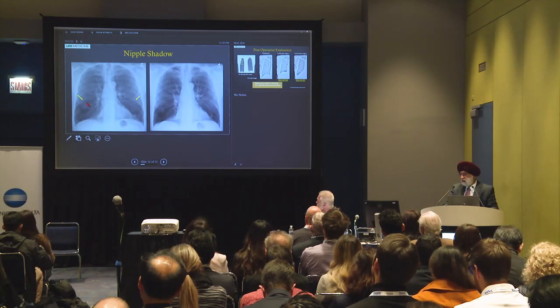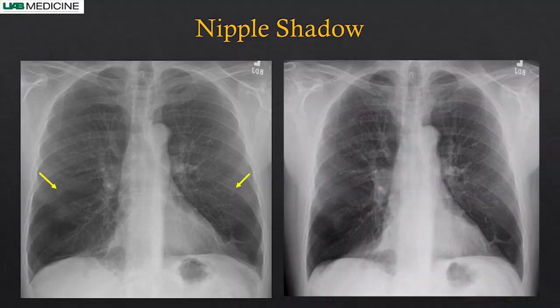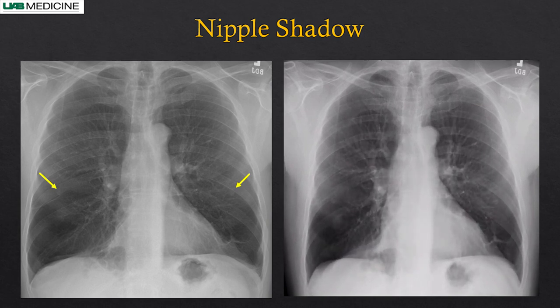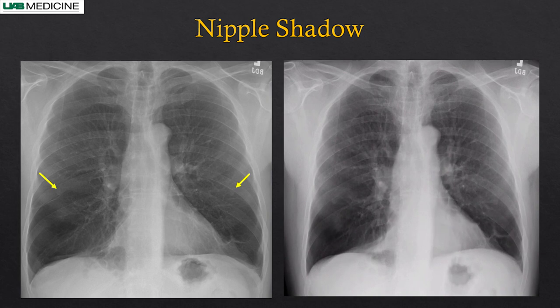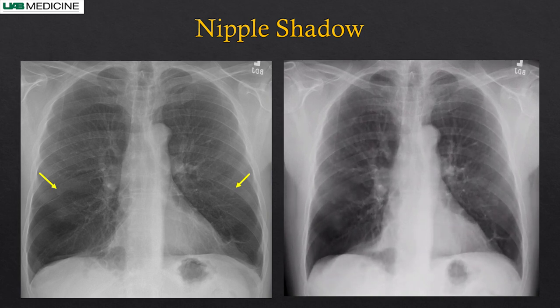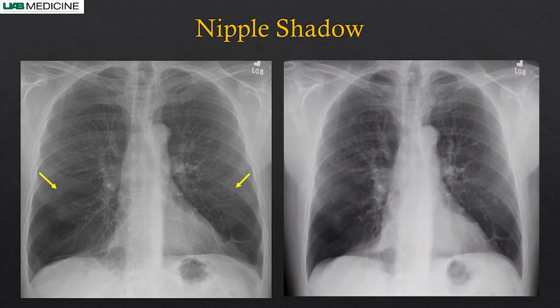We've all seen nipple shadow cases. If symmetrical, they're easy to confirm, but if on one side it can be difficult—their location is typically around the fifth or sixth rib anteriorly. With DDR, you can clearly see that the nipple shadows do not move with the regular lung motion, confirming this is outside the patient. In one examination you can do it, whereas otherwise you might need nipple markers and a repeat examination.